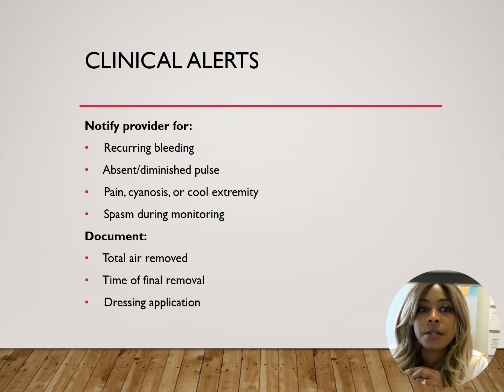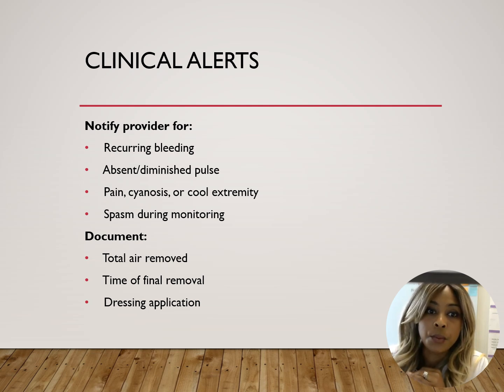Clinical alerts. So we're going to notify the provider for recurrent bleeding, absent or diminished pulse, pain, cyanosis or cool extremity, spasm during monitoring. We're going to make sure we document total air removed, time of final removal, and then dressing application.